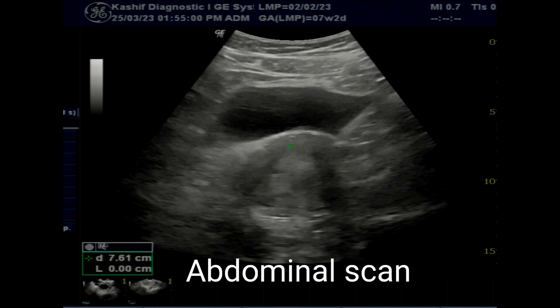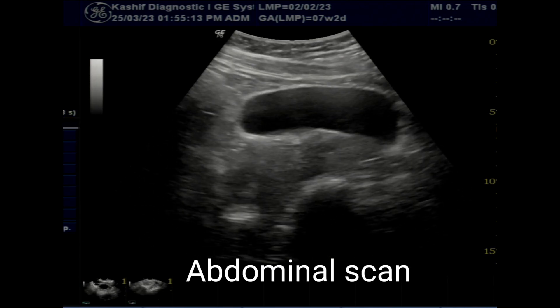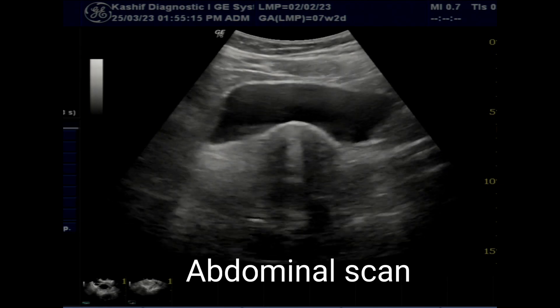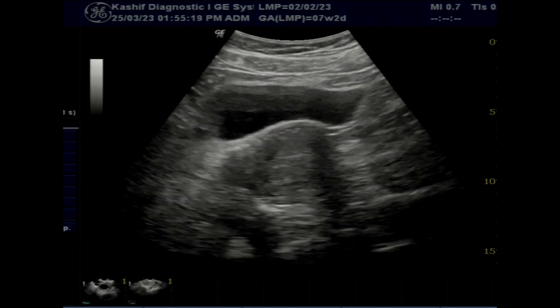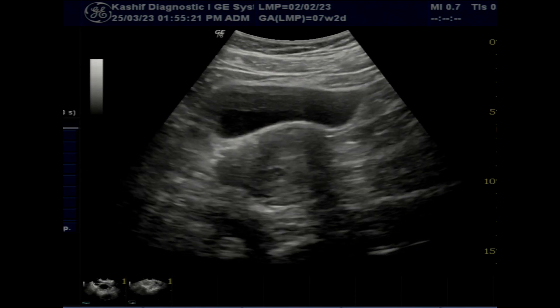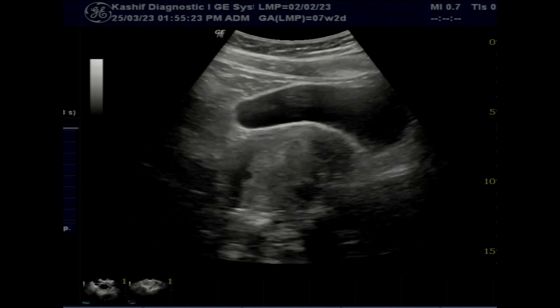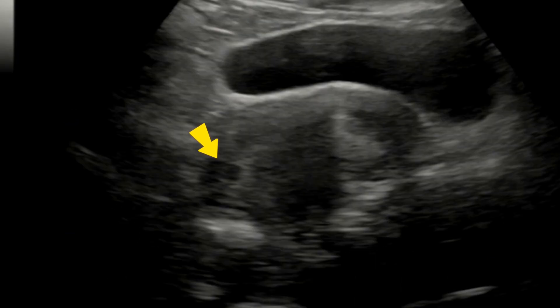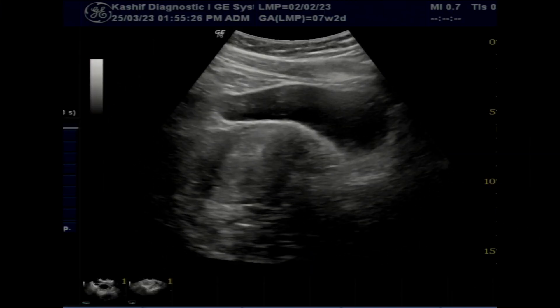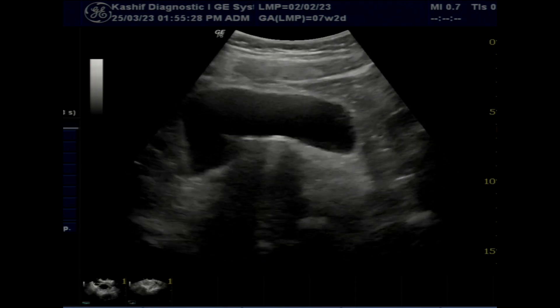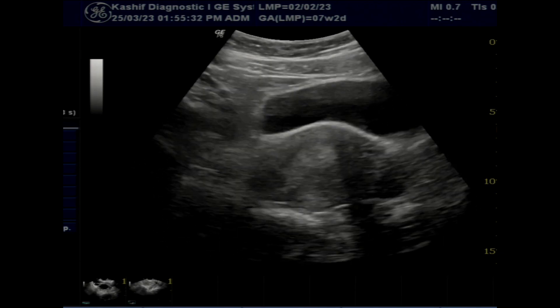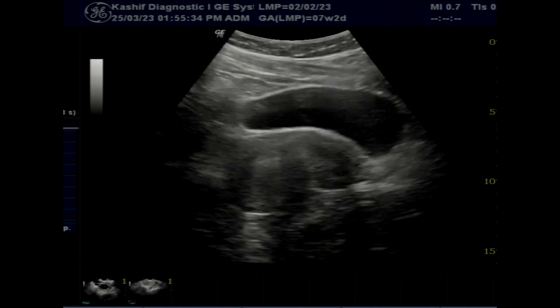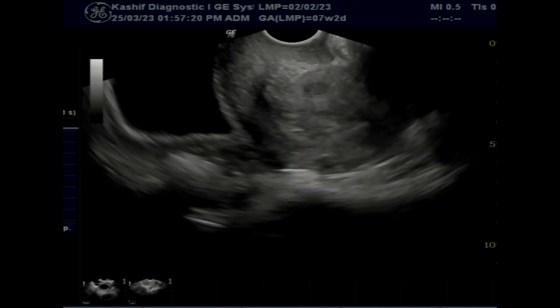This is a female patient with a pregnancy of about 7 weeks 2 days according to LMP and a history of bleeding from 1 week. Scan was done for viability. Abdominal scan was done and there is a small intrauterine gestational sac seen. The body of the uterus is retroflexed, so a clear view of the gestational sac is not visualized, and a TVS scan is done for a clear view.